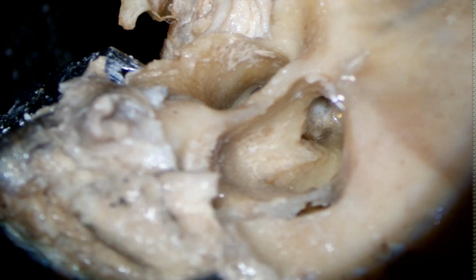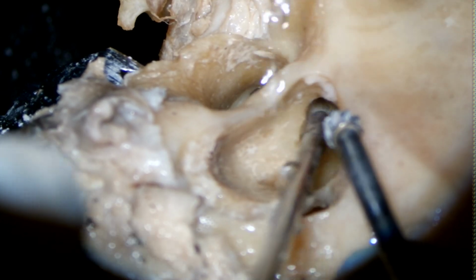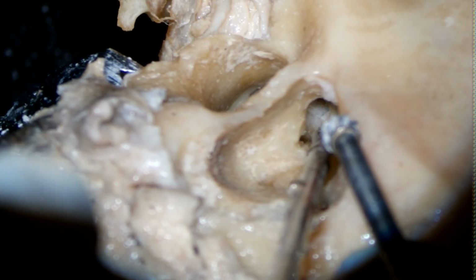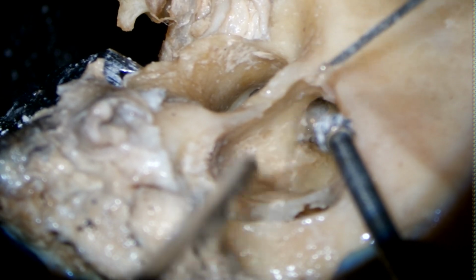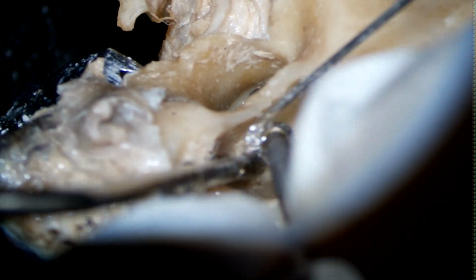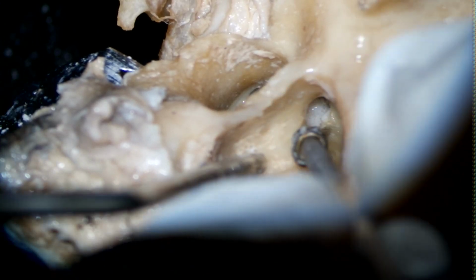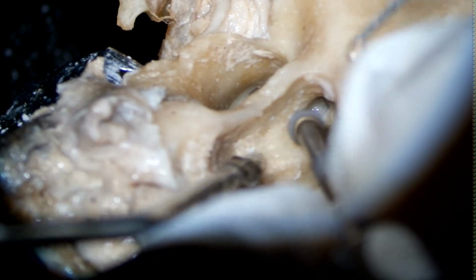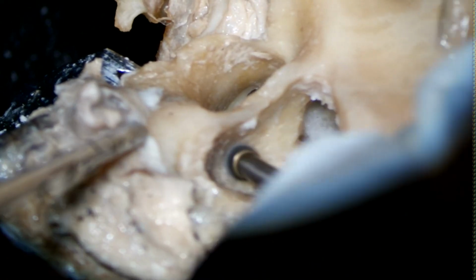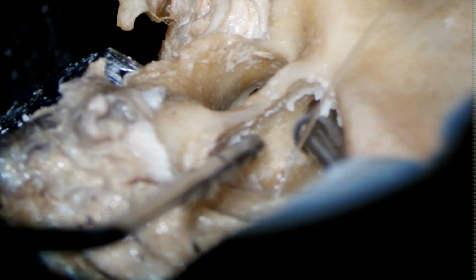Here the incus is absent, but when you have an incus present, here will be the body, and the short process of incus will point towards the facial nerve, right? So you leave a small ledge of bone and then start doing the posterior tympanotomy, right? So more thinning is required.